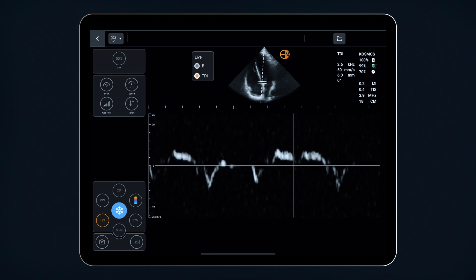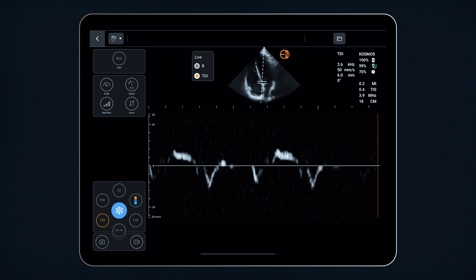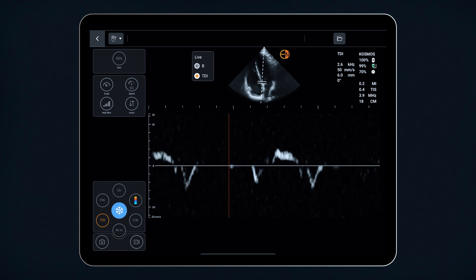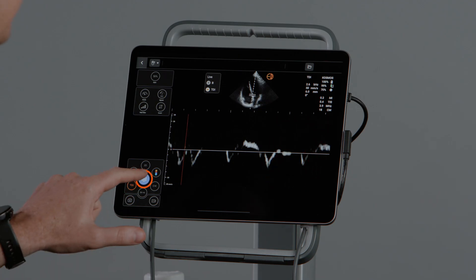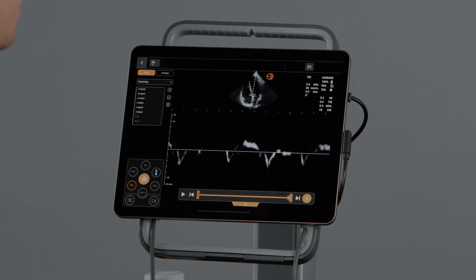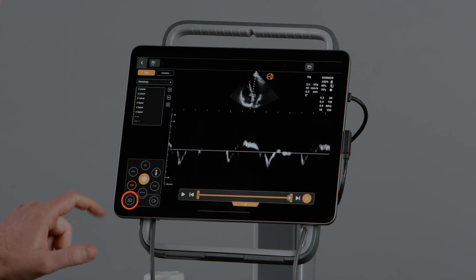Once you have an optimal waveform, freeze the image to take your measurements. Select the camera icon to save your measurements.